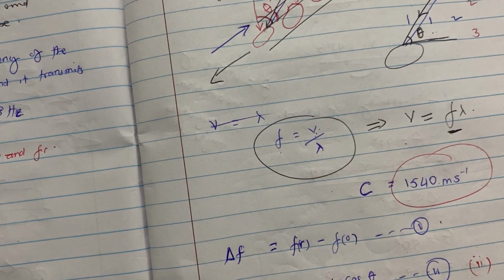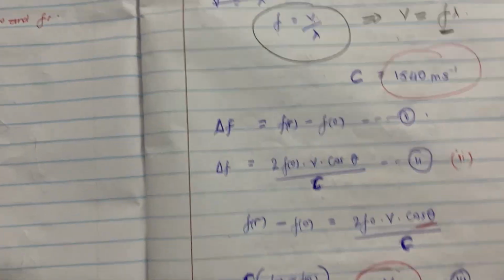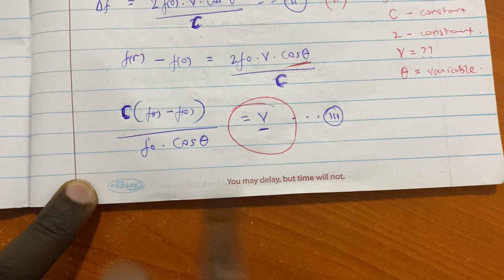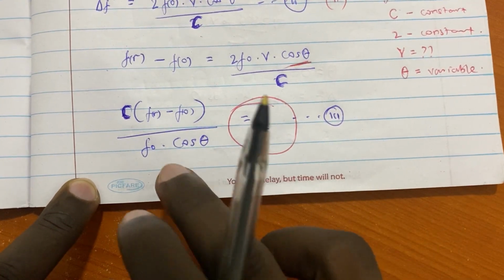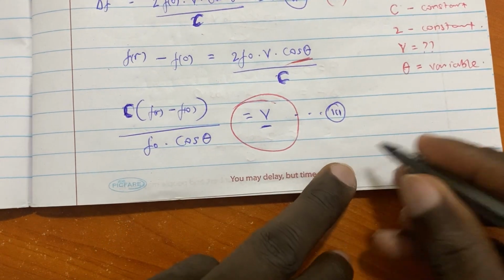What else is remaining? Doppler shift finished. C finished. V. So why this formula here? Because we don't know this V, and it's the one we are looking for. That's why we apply Doppler echo to look for this V. Why do we look for this V?